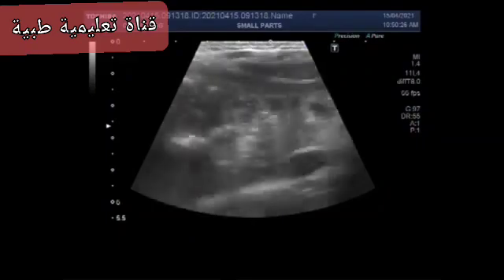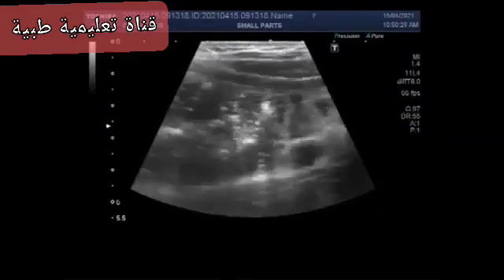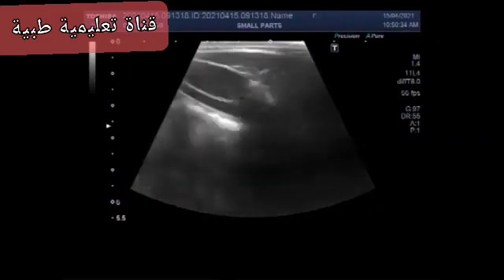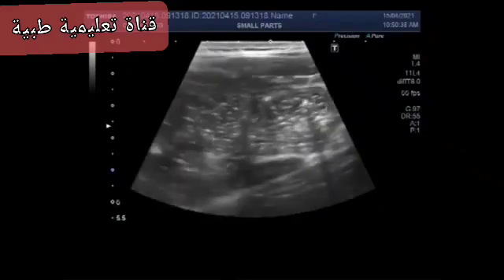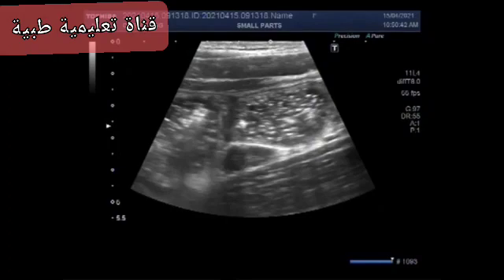This ultrasound video shows a case of localization of the inflamed appendix. Most often, healthcare professionals suspect the diagnosis of appendicitis based on the symptoms, medical history, and physical examination. A doctor can confirm the diagnosis with an ultrasound, X-ray or MRI scan.